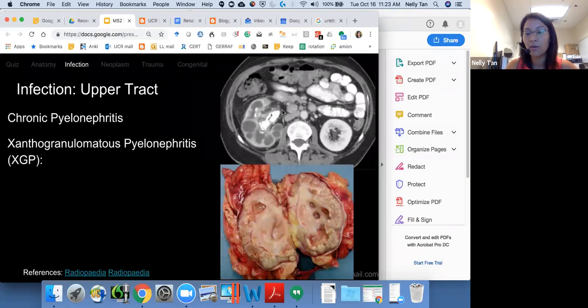Calcifications, yeah. So calcification in the renal system is called renal stones, and that's what this is here. So the patient has renal stones that are causing chronic obstruction. That's why we see calyceal dilatation with secondary renal cortex thinning. So this is what happens with chronic pyelonephritis. The patient never got their renal stones treated, so then it went on to this indolent infection, and then the kidney became sort of compromised.